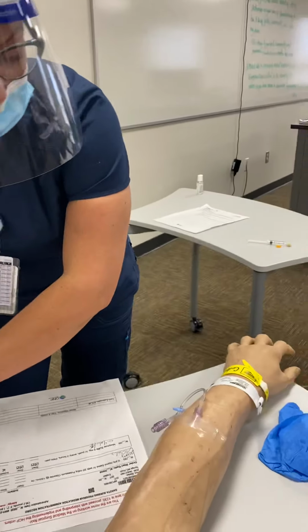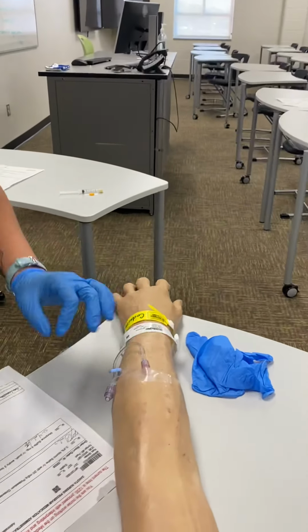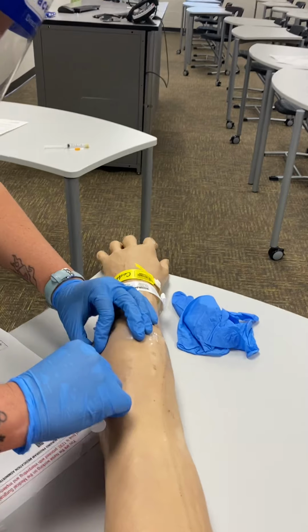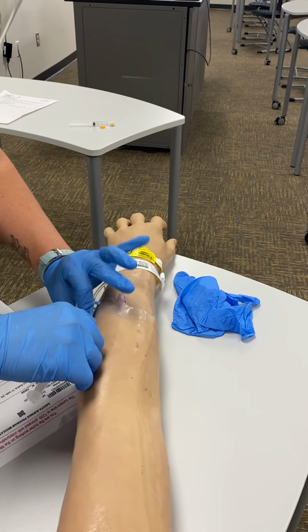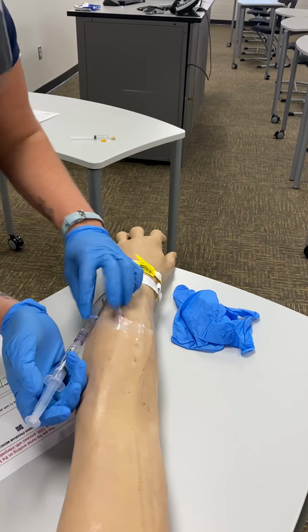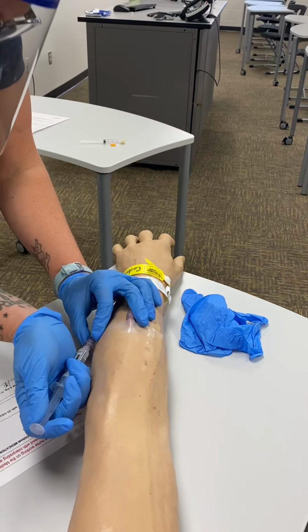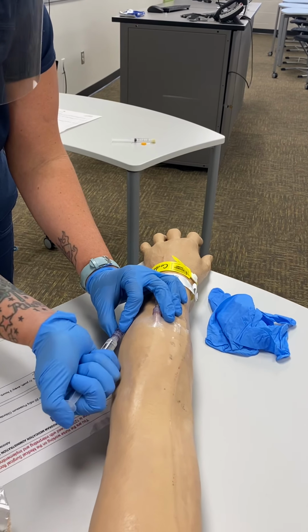So I would want to clean this port site again. Just scrub really hard, nice 15 seconds there. Attach. I have assessed the site. There's no signs of phlebitis. I'm going to pull back just a little bit and get a blood return to confirm patency right after I open that. And just gently flush.